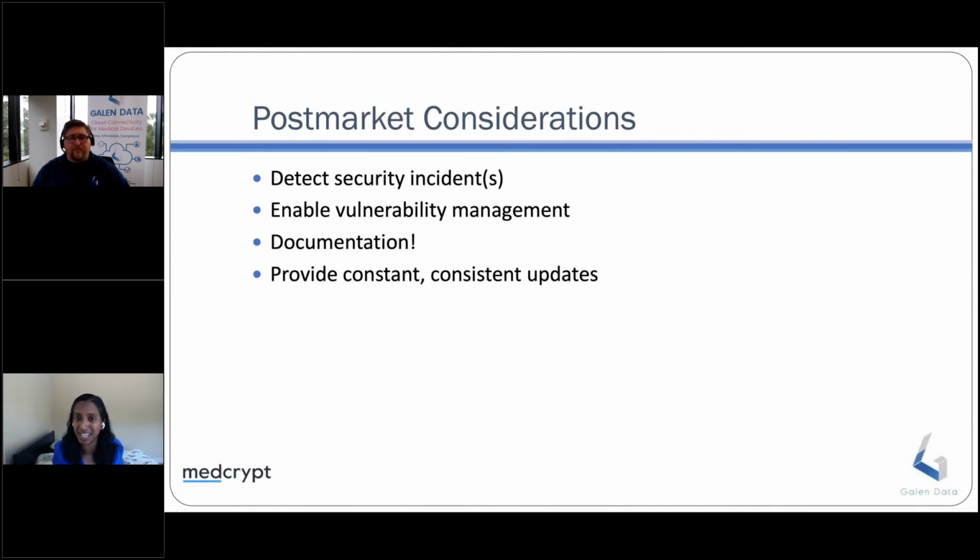And I think that's a huge part of this documentation bit, is feeding cybersecurity requirements into the QMS of device makers. That's how we develop devices in the medical industry, right? Like that is the golden standard by which everything reflects and how you're able to track completion. And I think embedding security into that is absolutely a way to go, and will force a lot of this documentation to happen before the device is even out the door. Absolutely.